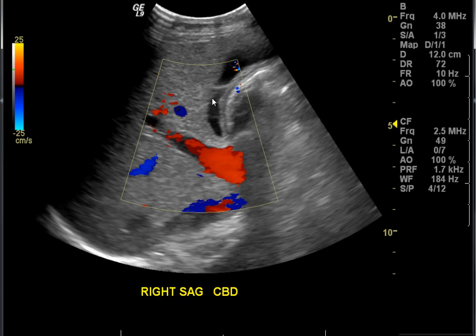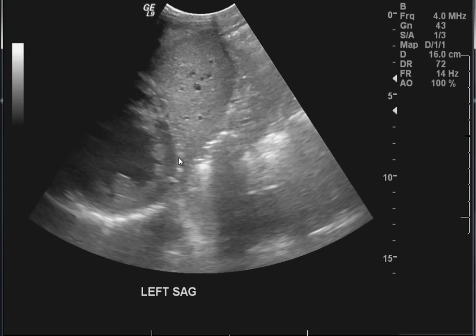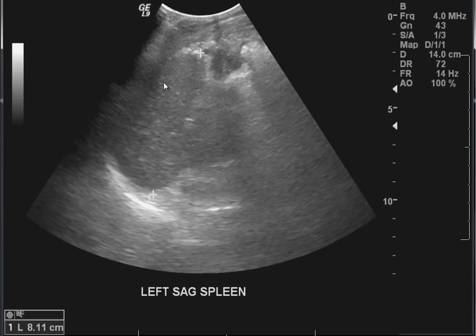Now you can clearly see those artifacts here over the gallbladder area. Now this patient happens to have a big heart, and we were discussing that he may be in hepatic venous congestion because his liver vessels are kind of prominent, especially the hepatic veins.